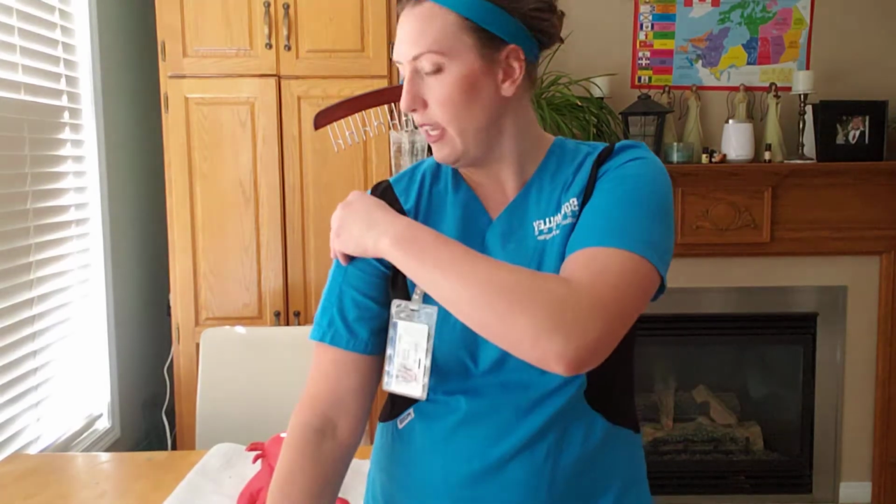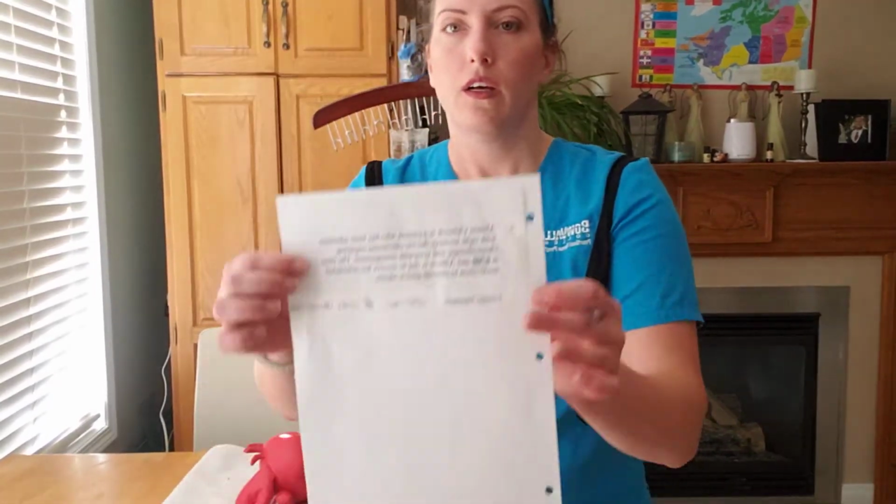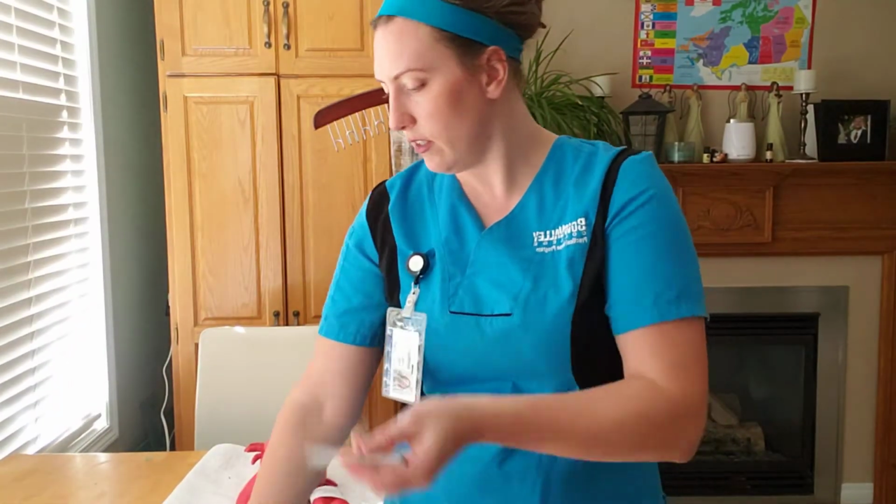The time is 0700 hours, and Allison is due to receive her scheduled medication to prevent gastric ulcers. So I'm going to sign this to indicate that I understand. Janine McIntyre, June 25th, 0700 hours.